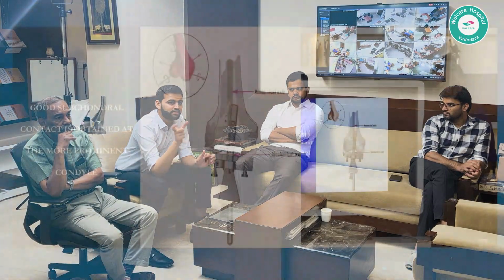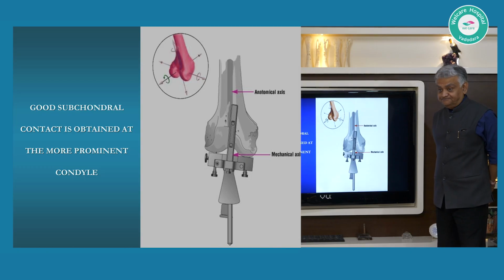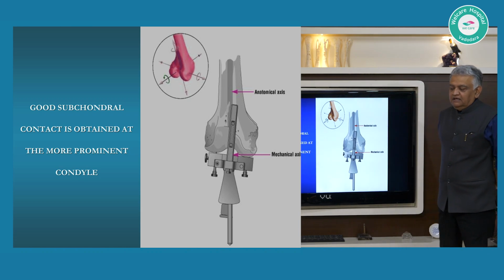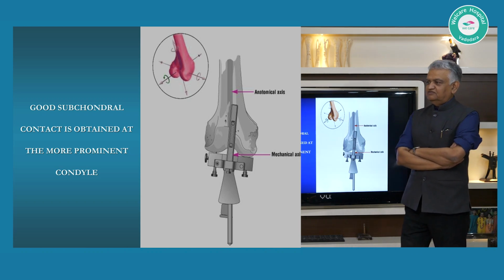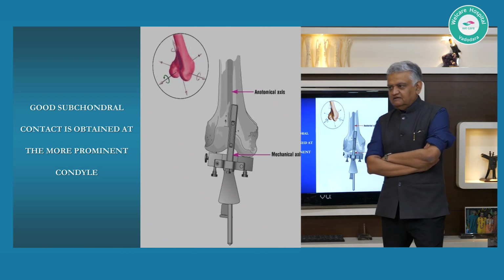Having understood the concept, just to have a better understanding of the orthopedic technology, when you say you have to take a valgus cut, what exactly does it mean in reality? So superb. So I hope you remember we had this incredible discussion on this. This is very important. This is one of the most valuable lessons you will take away from Bharat Modi and your time at Wellcare.